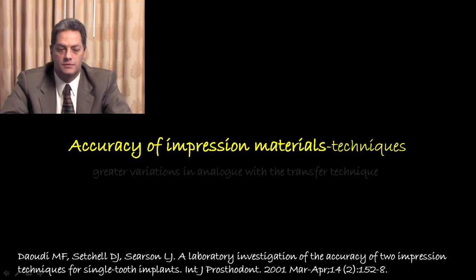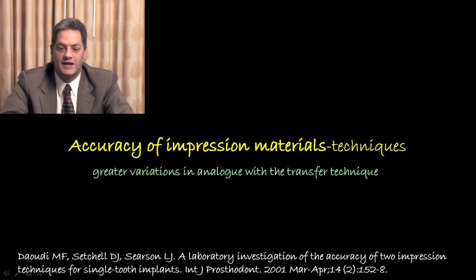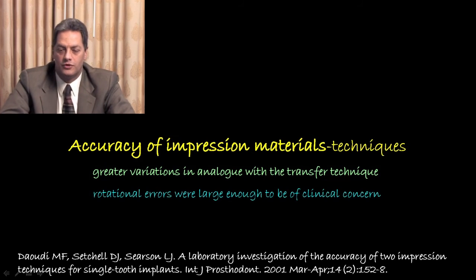On a different study, what they found is there was greater variation in analog with the transfer technique. Therefore, either the dentist or the lab technician is going to transfer the impression coping onto the impression, this could be a reason to actually create a problem, especially when we're talking about multiple implant restorations. So the rotational errors were large enough to be of clinical concern.